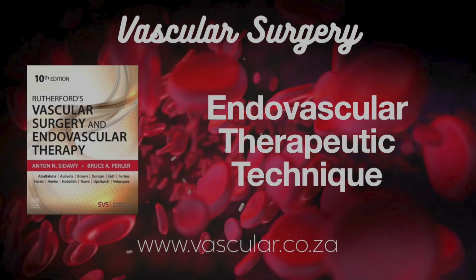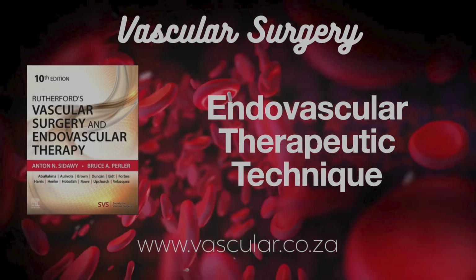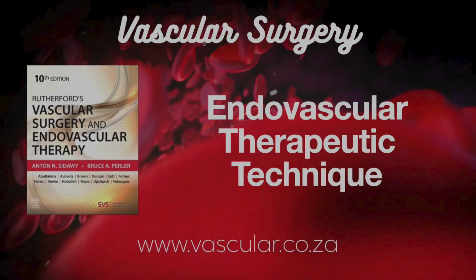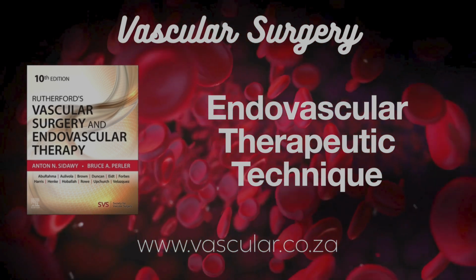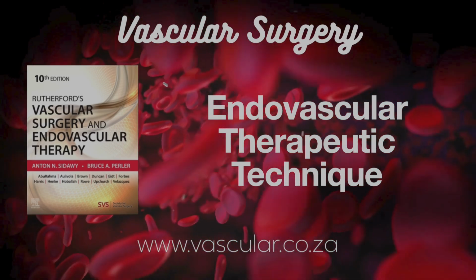What about the Viabahn endograft in the SFA? It's a self-expanding covered stent, indicated for long SFA lesions. VIASTAR showed better results than bare metal stents, even for very long, 20-centimeter lesions. Can be an alternative to bypass surgery for high-risk patients with complex SFA disease.